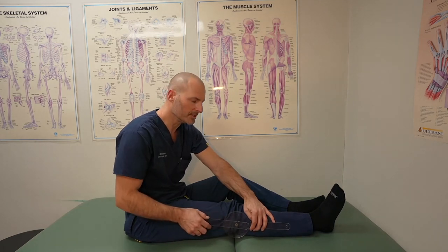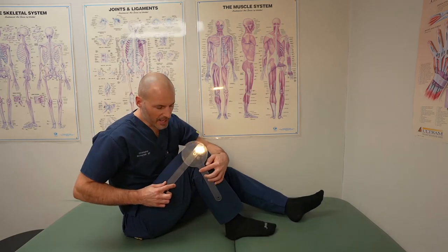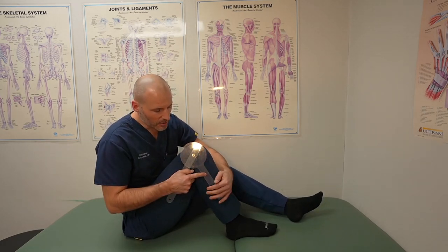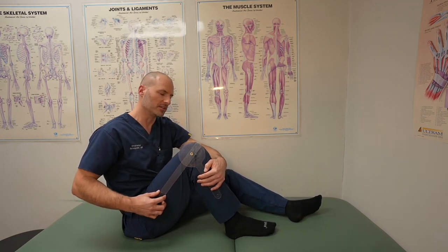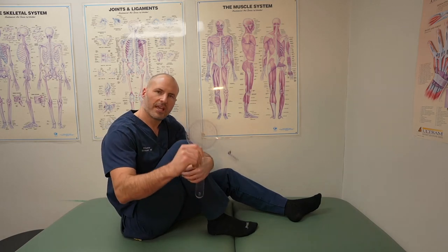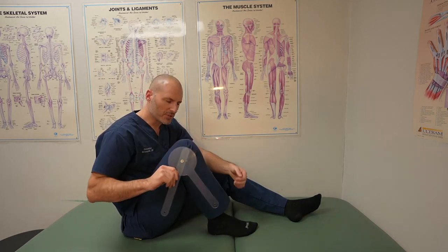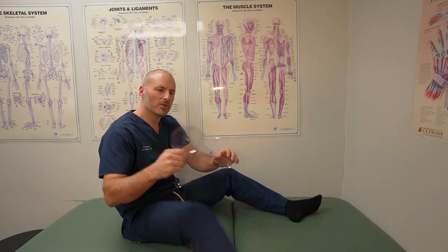When it comes to bending the knee, we call that flexion. Aligning the goniometer with the axis of the bones is how it should technically be done, and then you read off the angle. Here I'm demonstrating 125 degrees in the position I just showed.